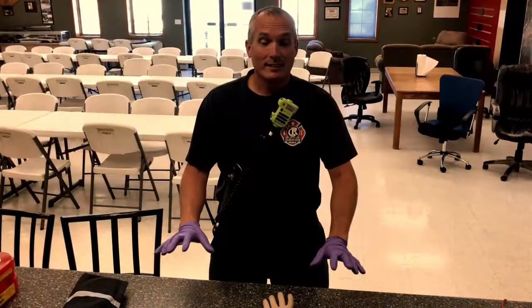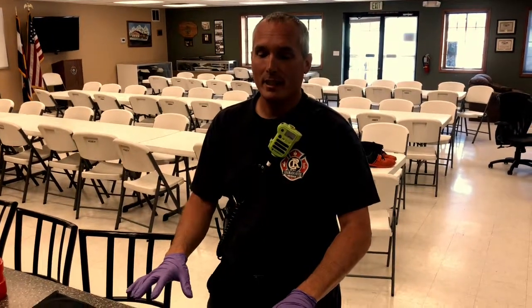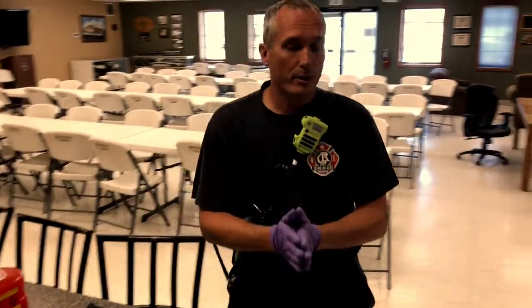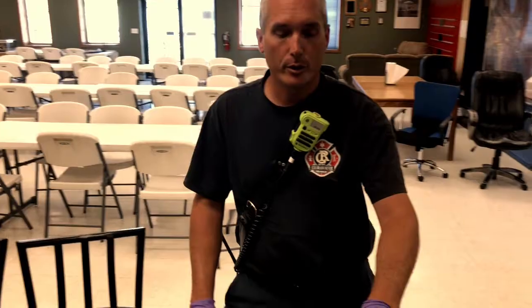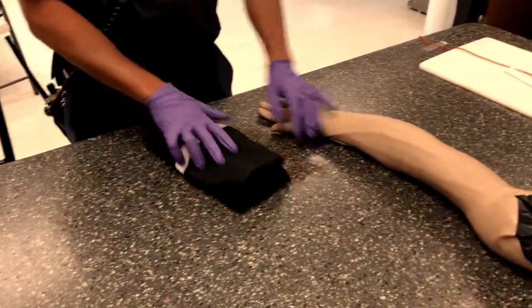Hello, this is CRFR's demonstration of initial IV start on a patient. This is a refresher for most, and some of you this will be a new skill. So let's get right to it. A couple of different demonstrations today. Firstly, we're going to use a mannequin, and keeping it real, we have our live stuff here, and we're going to do initial setup.